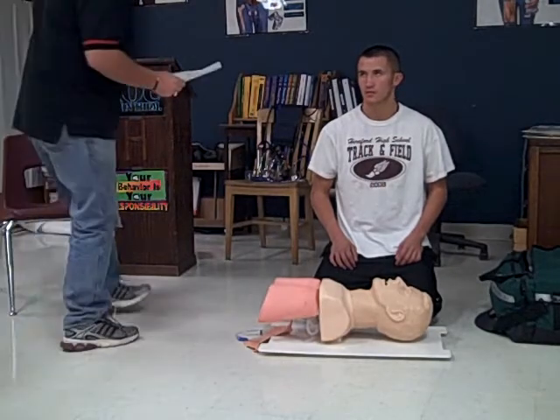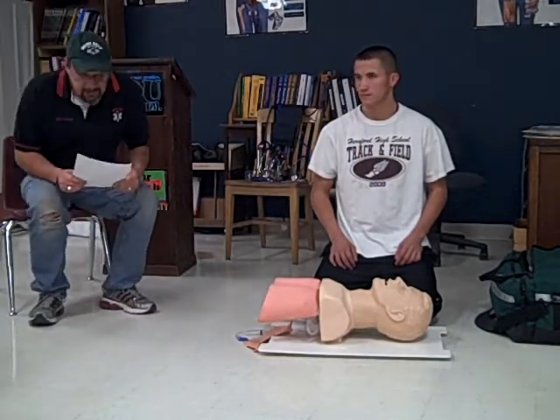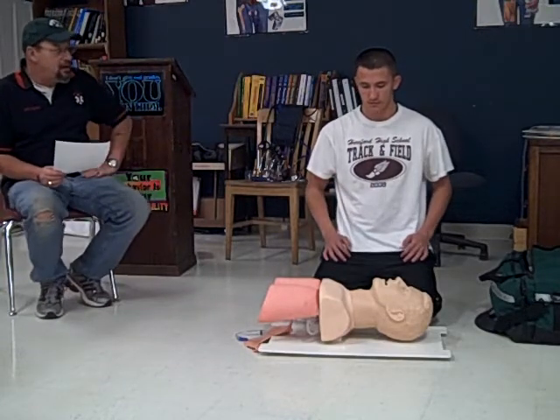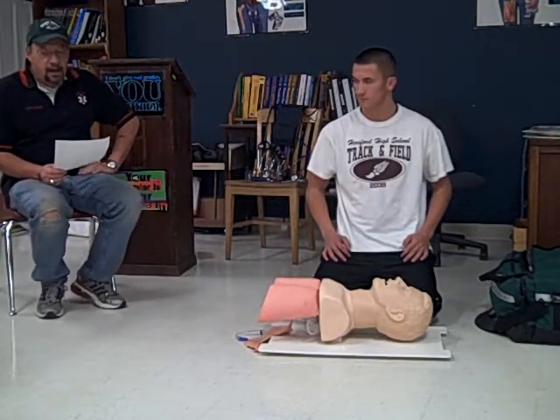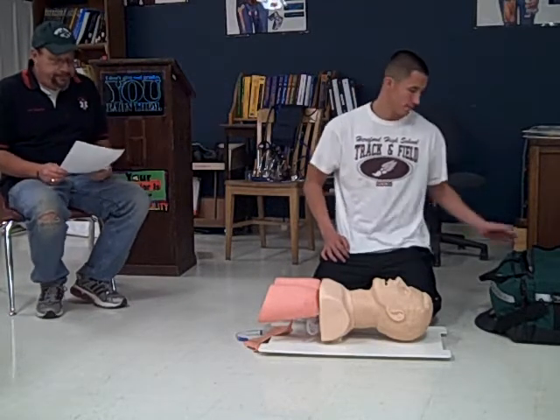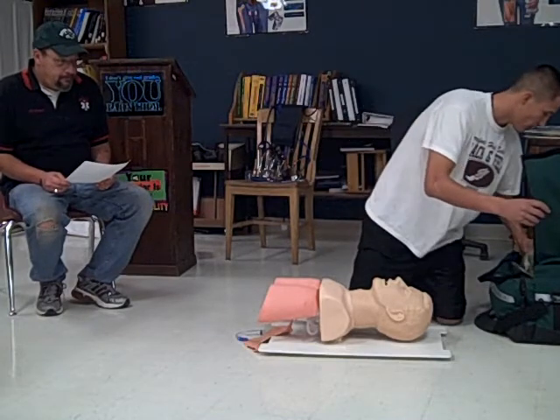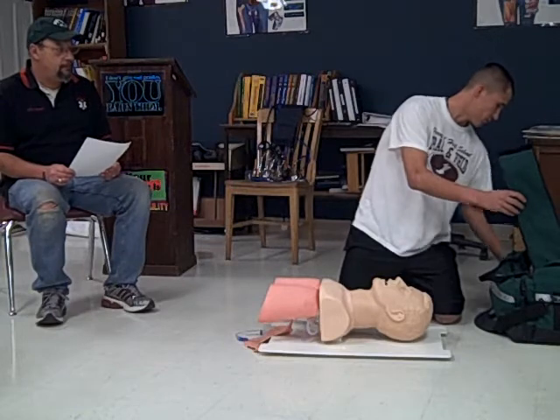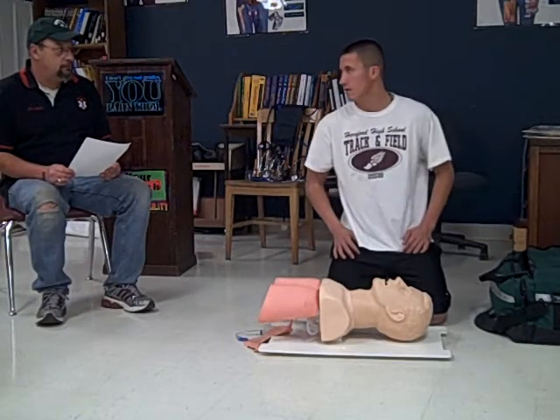Welcome to the bag valve mask of an apneic patient. On this skill you will be required to ventilate a patient who is not breathing using a BVM and then applying supplemental oxygen. Do you have any questions? May I check my equipment? Yes you may. May I begin?